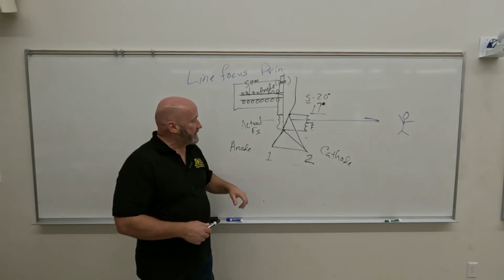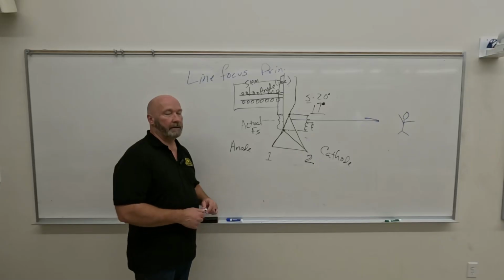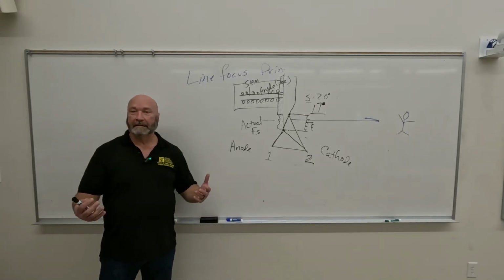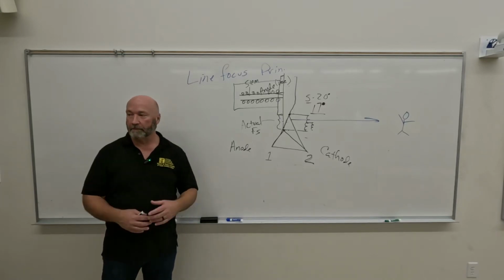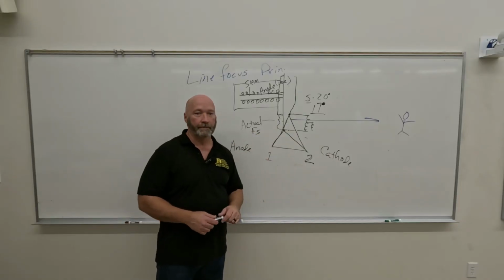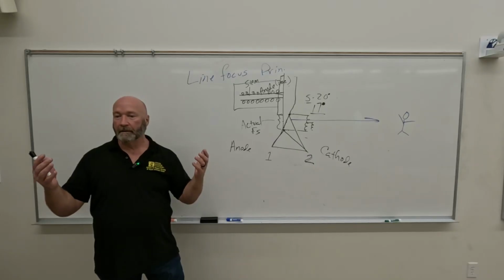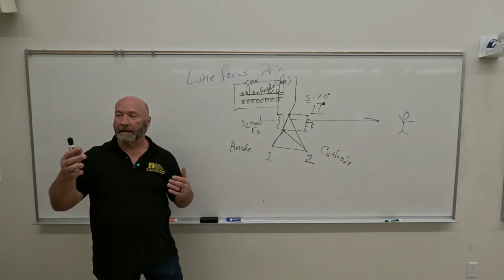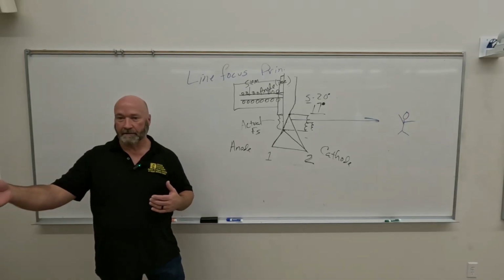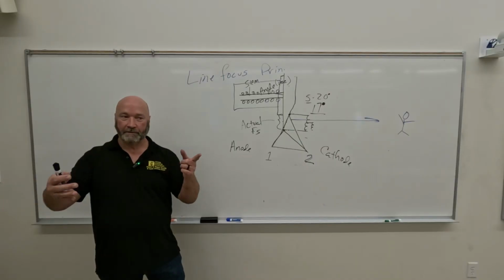So what causes the difference in intensity between the cathode and anode end? What causes a decrease in intensity at all between where we create X-rays and where X-rays come out of the X-ray tube? Is it the metal? I'll give you a hint: absorption of low energy X-ray photons. Maybe not kVp, that's creation.